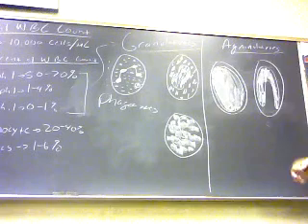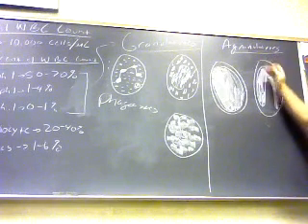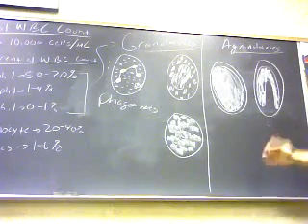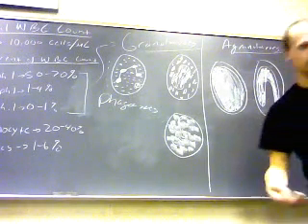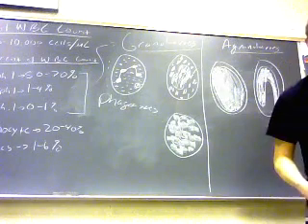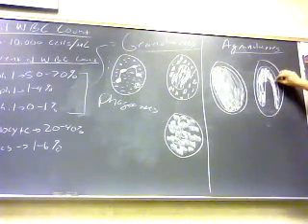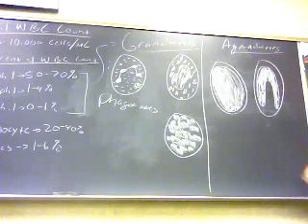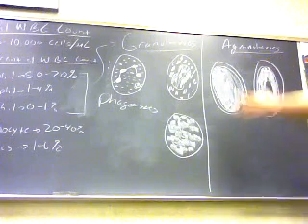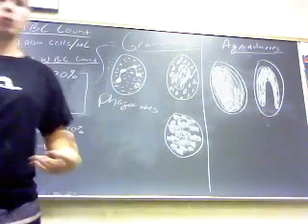They're phagocytes, but after they migrate into the tissues, physically, morphologically, they will look different, because they adapt to the tissue environment that they're now housed in. But this is what they're going to look like before they get into whatever tissue it is they're trying to migrate into: the big horseshoe-shaped nucleus. And that's basically your white blood cells, how you tell them apart and what they look like.